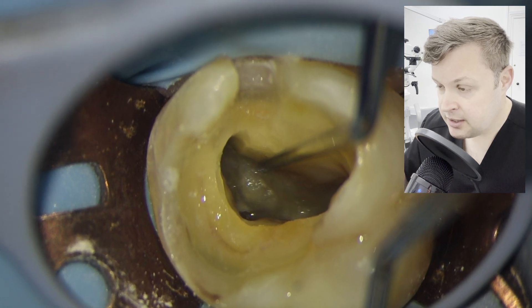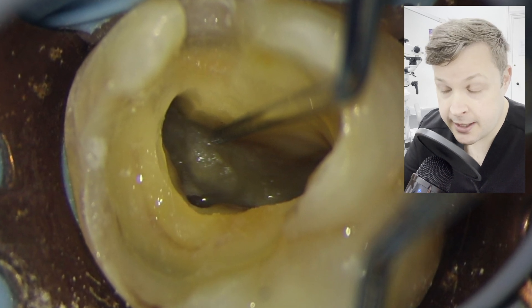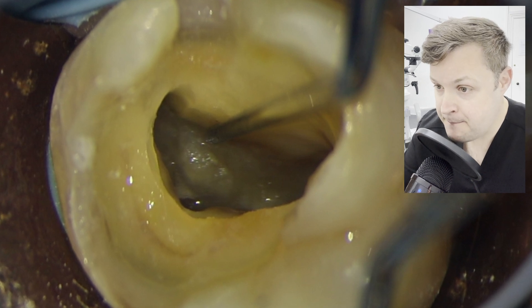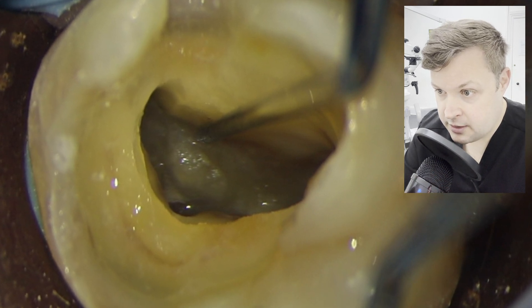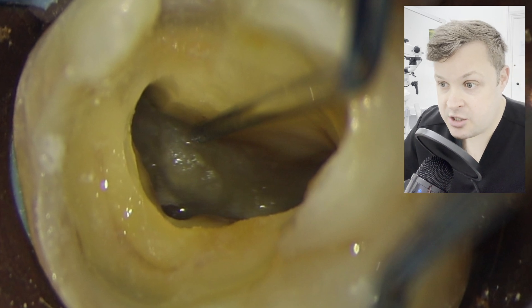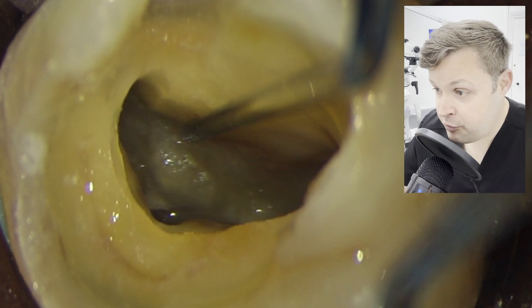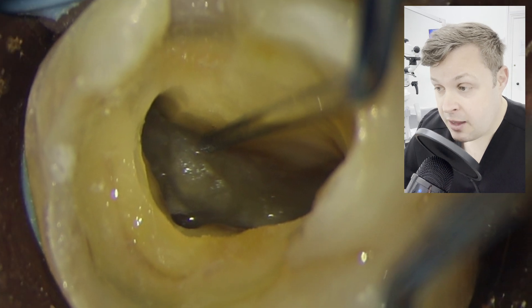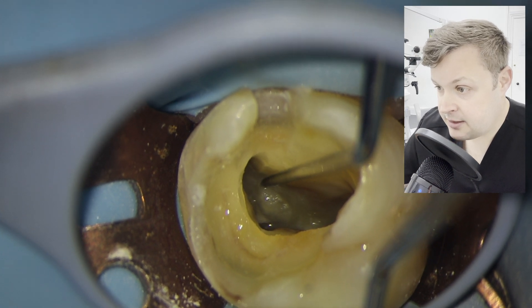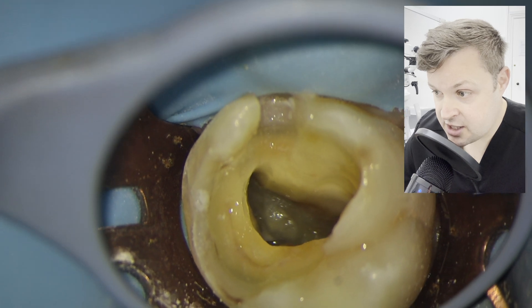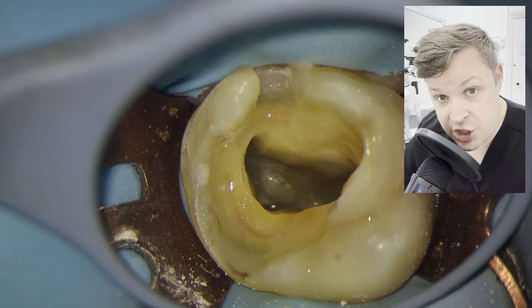At this point, I'm going to pause the video. I'm thinking to myself: is there or is there not an MB2? On the x-ray, some people would argue the MB root looks quite narrow, so there's an argument to say maybe there's not enough space for two canals in there. Nevertheless, I will look for it. Looking in this direction on my microscope, I can see a little bit of a fold of dentin, and the MB2 will be hiding under this shelf of dentin here.